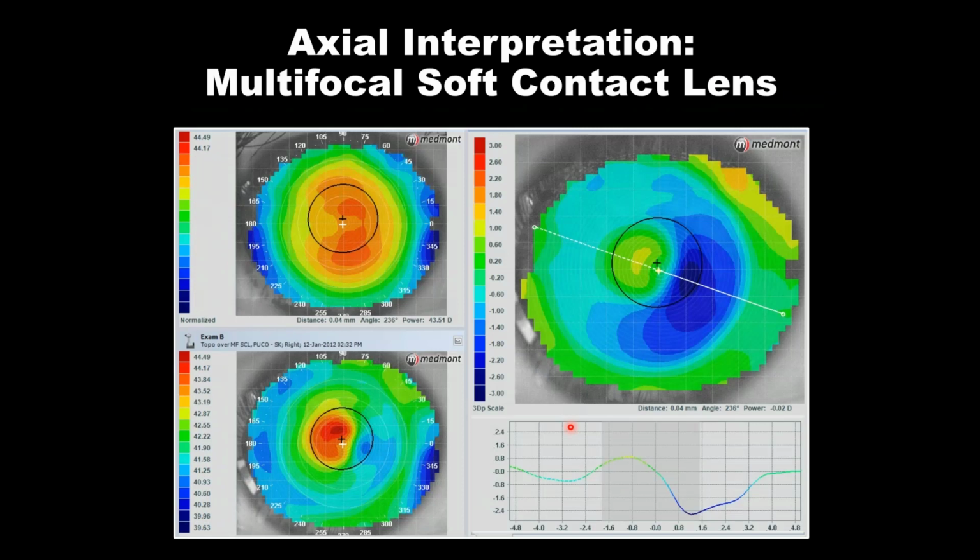Related to soft multifocal lenses, again, the same story is true. Let's focus in on this area within the pupil to have a better understanding of if we've done a good job.